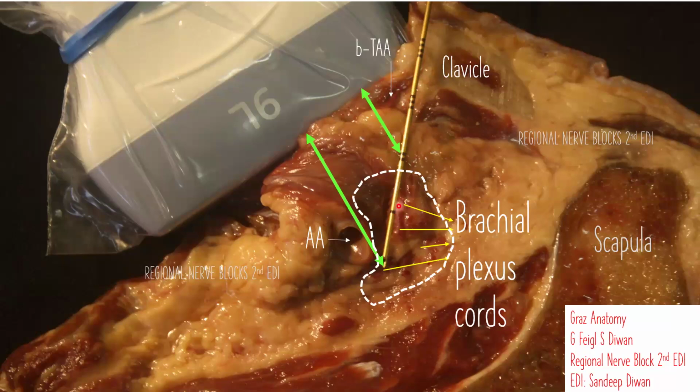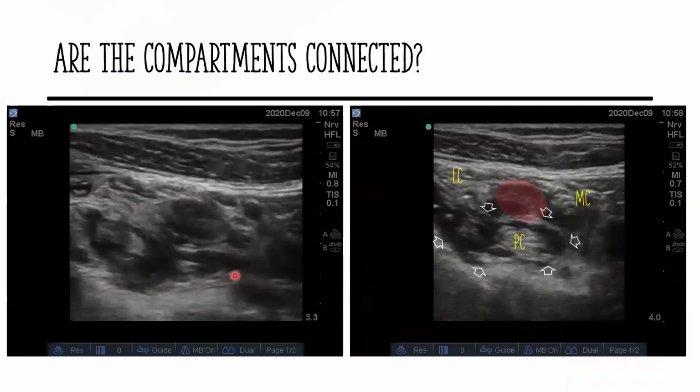that the lateral cord will come in the way when you are trying to position a needle posterior to the artery. So a couple of important things I mentioned, you have to keep in mind. You can see the beam is not equal. It starts with very minimal and then it increases as you go deeper. It means that the tip of the needle might be difficult to visualize. So that's the brachial cord.